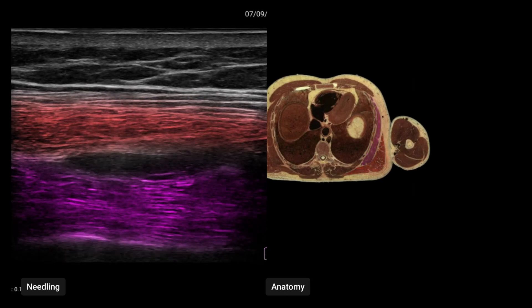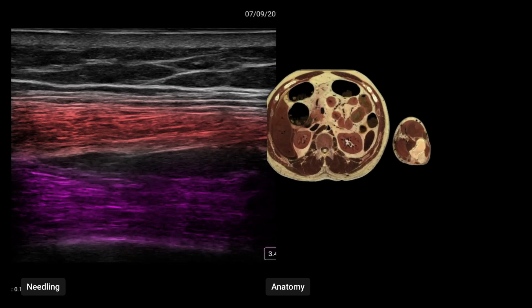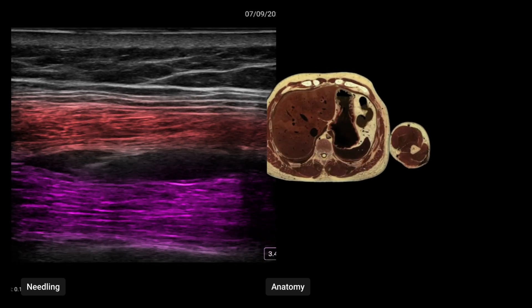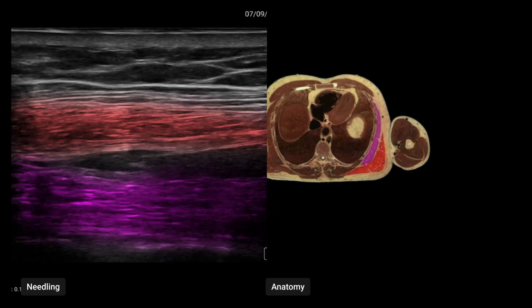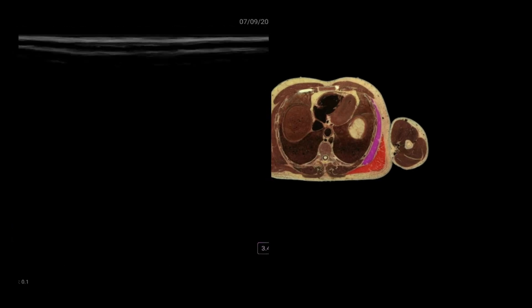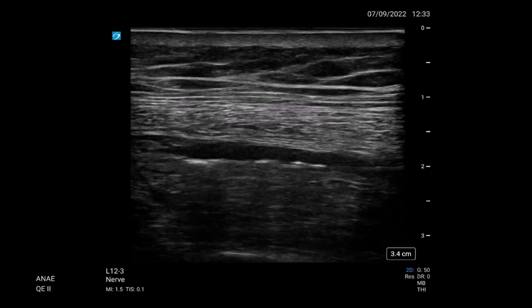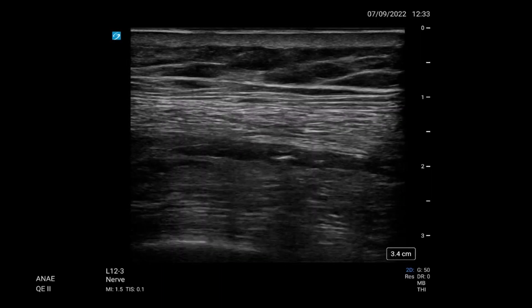Now if we're placing a catheter, the same principle applies — we try and move that catheter under the fascial plane as far as we can, much like a fascia iliaca catheter. We want as much of it in that plane as possible. We've threaded the catheter, secured it, and we're doing a post-catheter scan confirming that we're still in the same location.